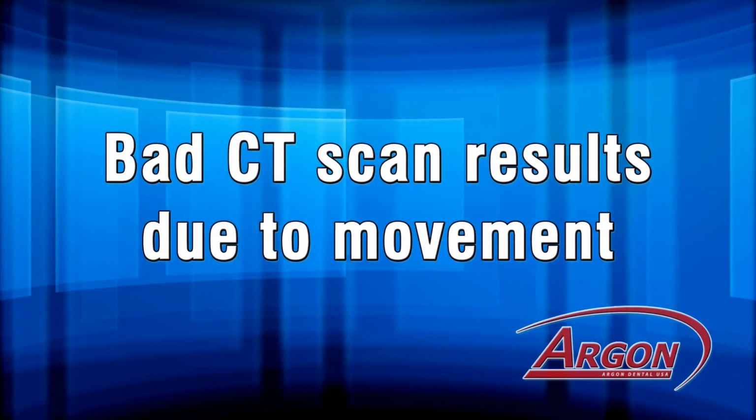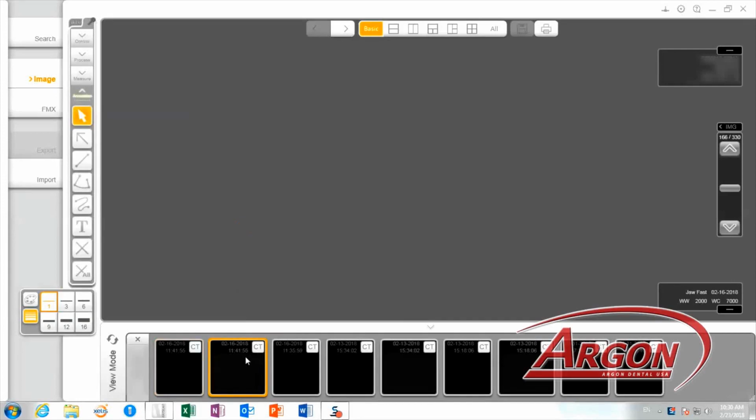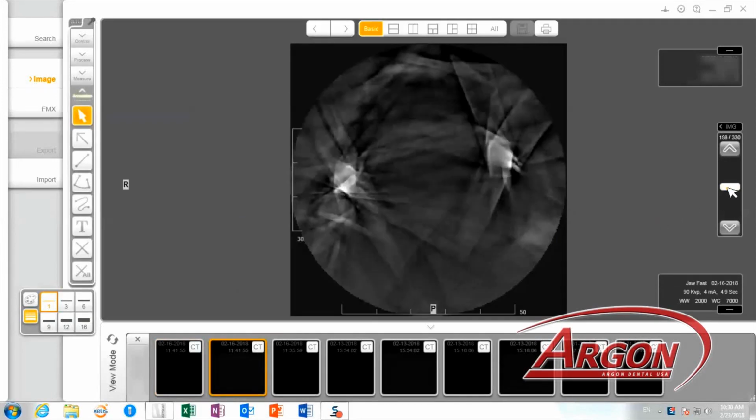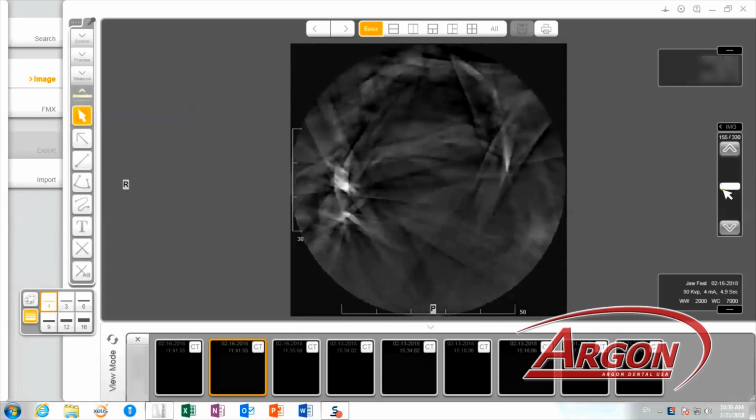Here's the result of what that movement would look like. You can see that the CT scan is not very clear. It's very fuzzy. This is a bad CT scan. If that would happen, please retake.